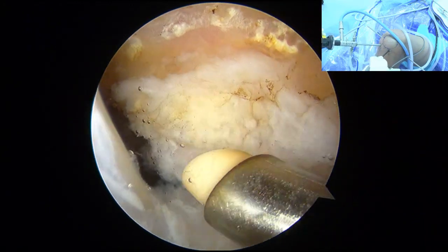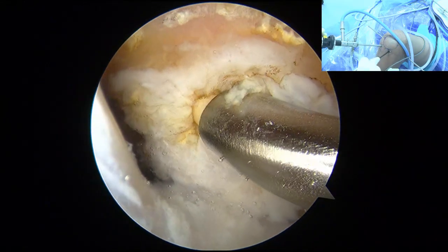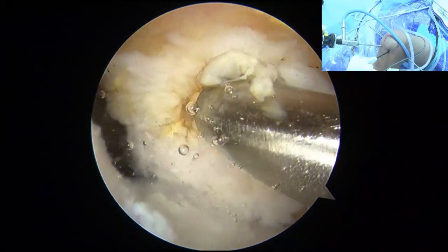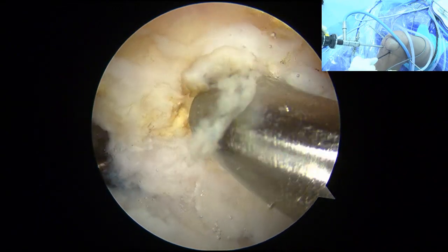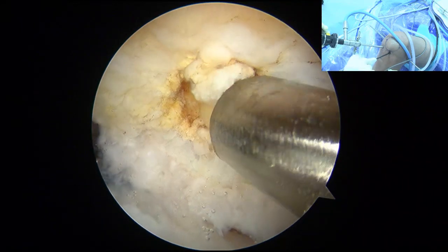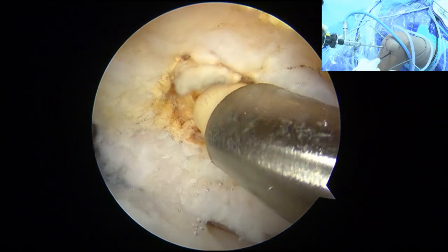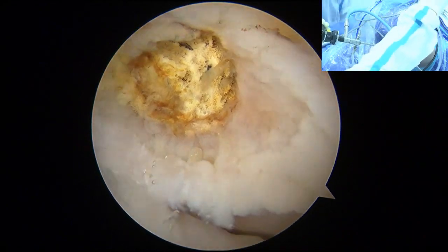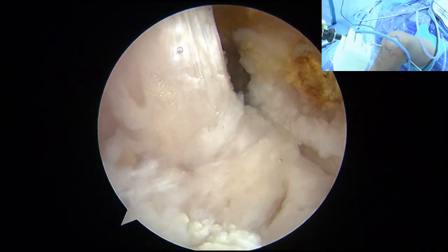Okay. So now really nice. So I will mark here the central of my ACL. If you have the fresh ACL injury, okay, you can use this landmark. Okay, and then if you put in the center, that should be the best, right? 然后在足印的中央中心标记隧道点，这一点呢在新鲜伤的病例当中比较好找。 Okay, good. That is our central. Okay, ACL. You agree? Okay. 这点是中心了，对吧？ Very good. So that is our femoral. And then we go to the tibia, okay?